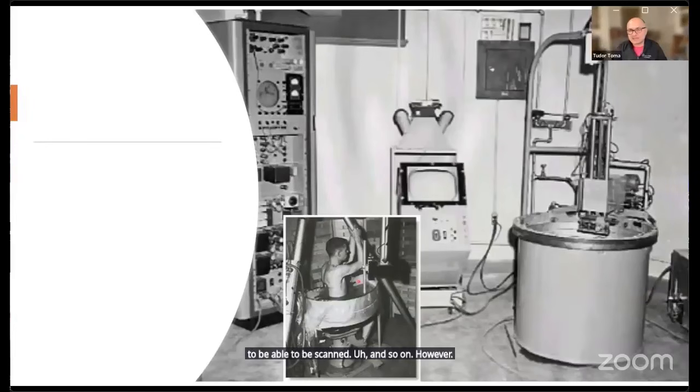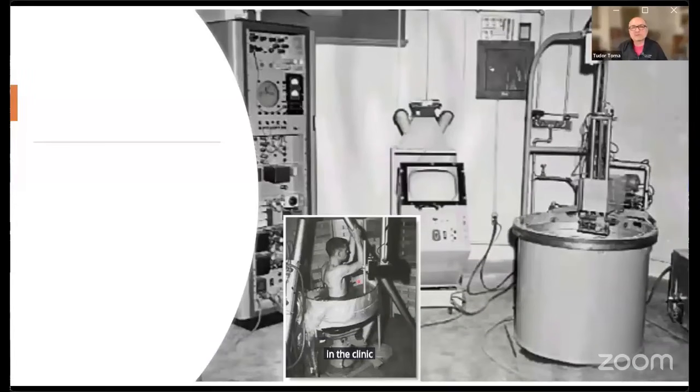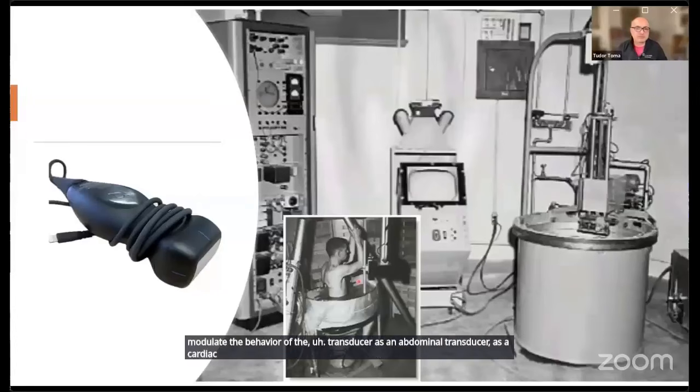However, we all know that the technique has progressed, and the ultrasound system that I'm using mostly in the clinic, on the ward round, and also with me in the bronchoscopy room is this device, which is a pocket ultrasound. It's one of the devices that has a lot of flexibility in its use, because it has a technology which allows you to modulate the behavior of the transducer as an abdominal transducer, as a cardiac transducer, or as a linear transducer, and therefore you don't need to change the transducers anymore.